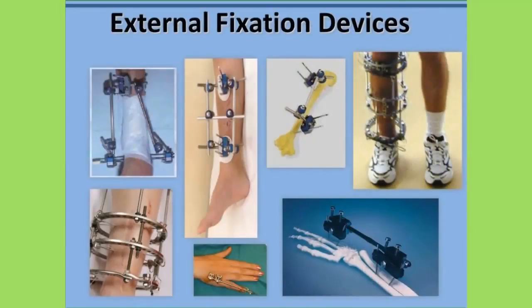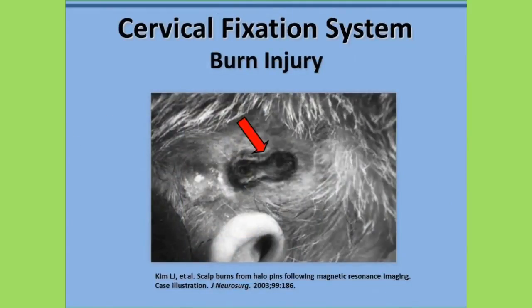Orthopedic implants classified as external fixation systems can pose serious hazards to patients, even if they're made entirely from non-magnetic materials. External fixation devices come in a variety of configurations depending on the indication for patient management. These orthopedic devices are tested for MRI issues on a configuration-by-configuration basis. Some are safe and some are unsafe depending on the configuration and the MRI conditions that are present. Because of this, it is vital to refer to the specific MRI labeling information for a given external fixation device in order to ensure patient safety.